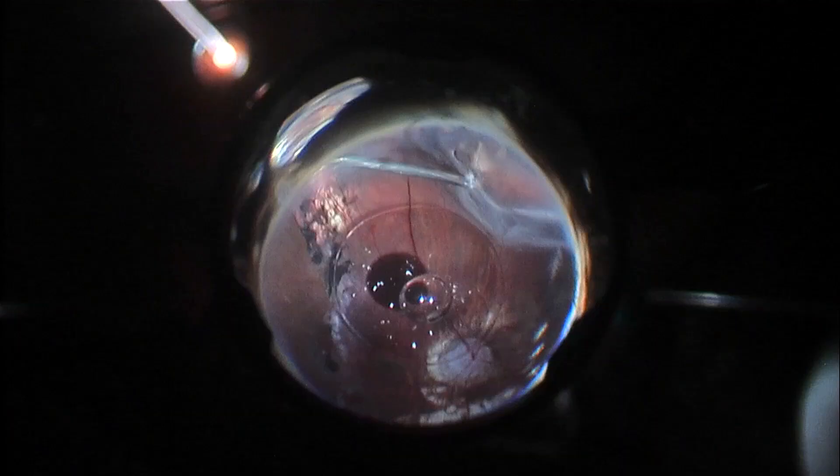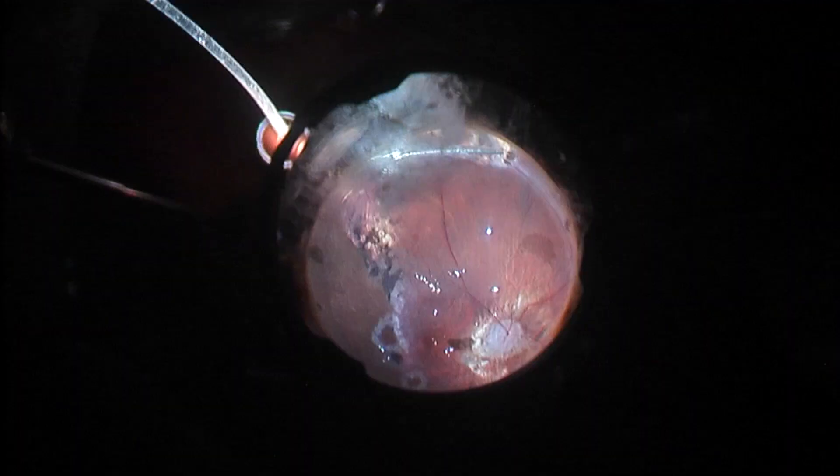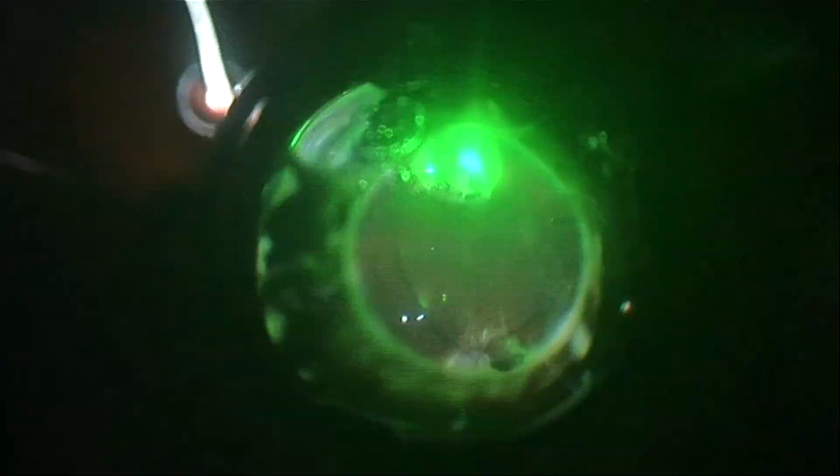I am marking the retinal tears and performing laser at the posterior pre-existing retinal tears and also at the micropore at the peripapillary area of atrophy. Now I am doing fluid-air exchange using PFCL-air to remove completely or almost completely the subretinal fluid, and performing laser 360 degrees. This was the only eye of the patient, so I decided to leave silicone oil in.